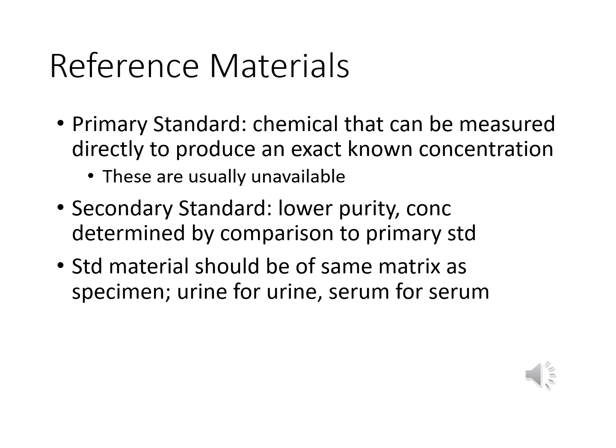The standard material should be of the same matrix, or the same type of specimen. So if we have a urine specimen, that reference or secondary standard should also be urine, and the same goes for serum or plasma as well.